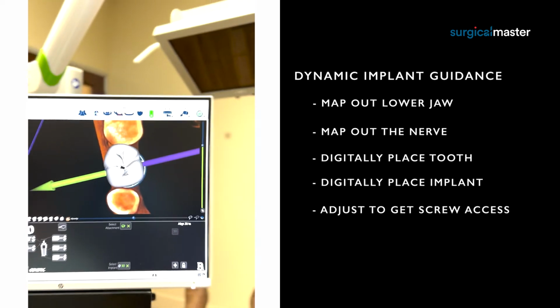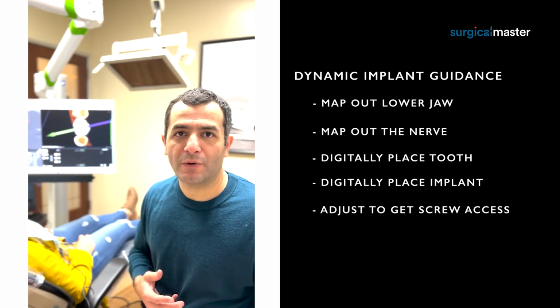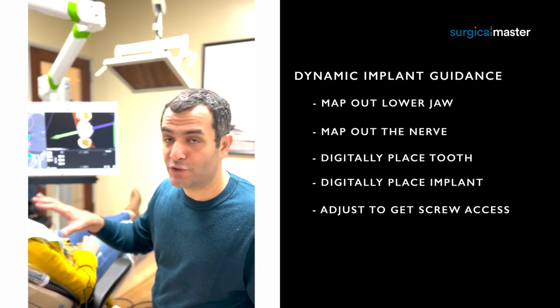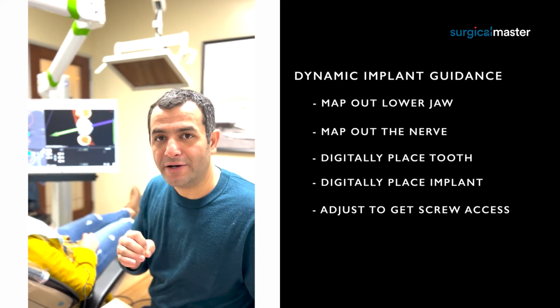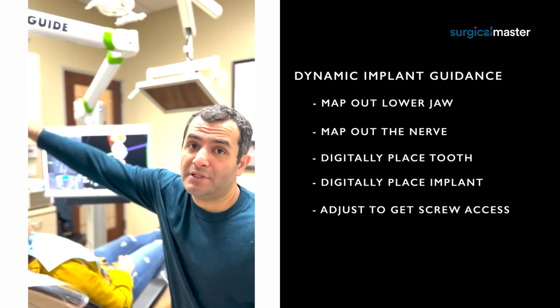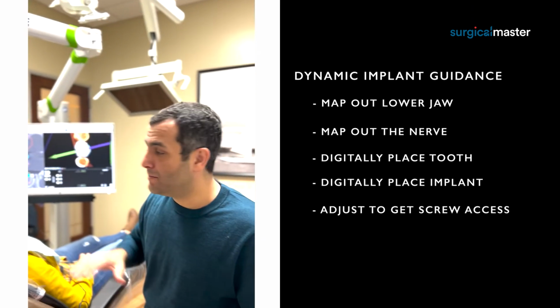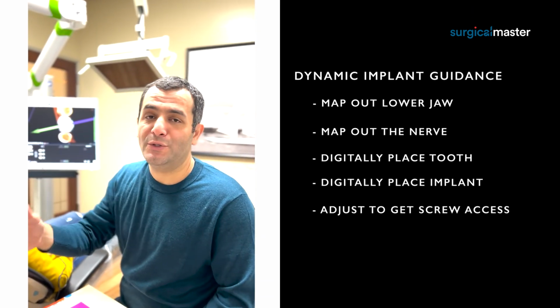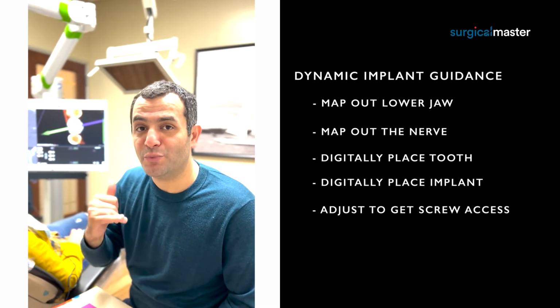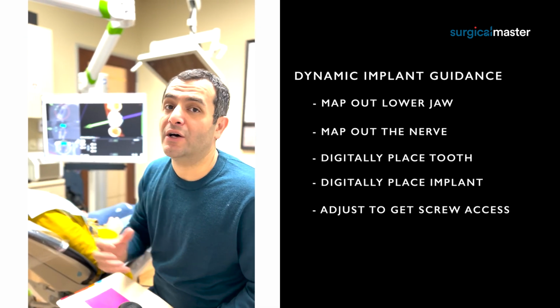Okay, so now that I designed the implant, and look, it didn't take long. I mean, we've been doing this for what, like 5 minutes, right? I'm going inside the surgical site with the utmost of clarity. Next, I'm gonna calibrate my handpiece with the 2 cameras that are present on the dynamic navigation machine, and then gonna make sure the patient is numb and do the surgery, and you're gonna love the level of technology, precision, predictability that dentistry can offer now to patients.